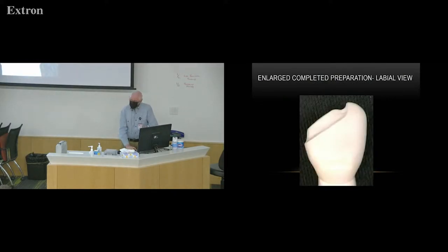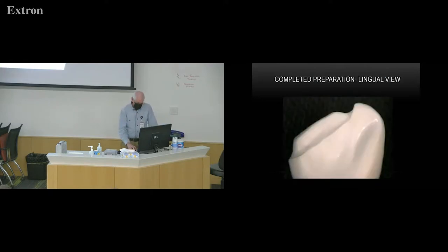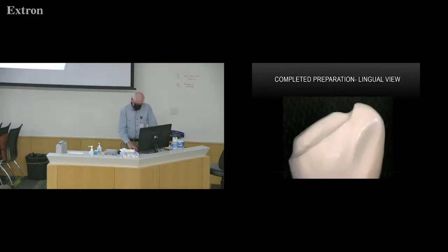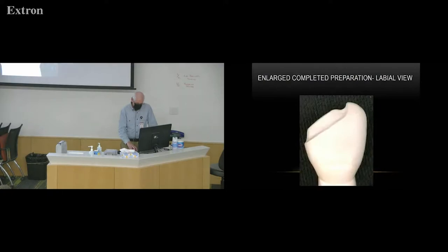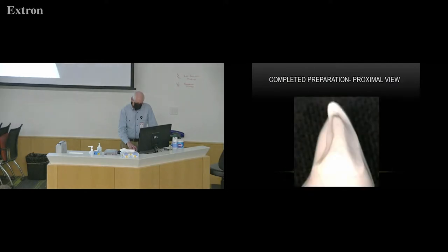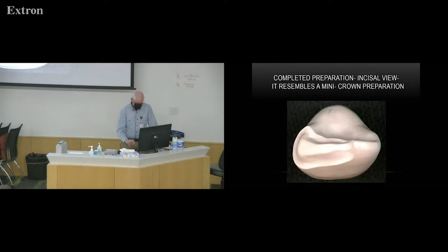So here's some different views of those plaster models. That's the labial, and there's the lingual. That's what it looks like from the proximal view, and that's what it looks like from the incisal.